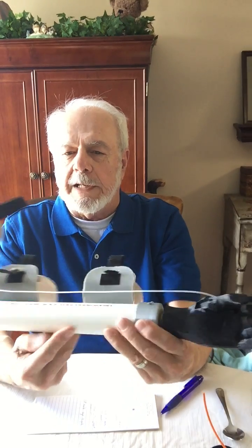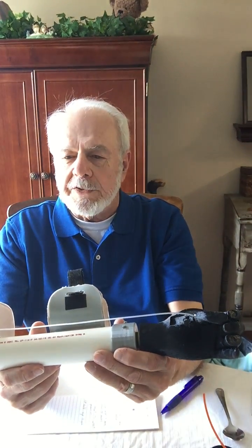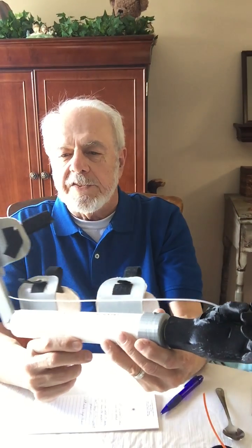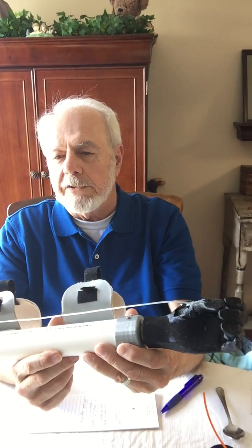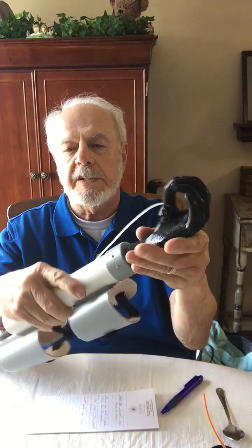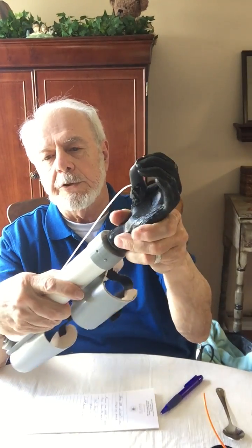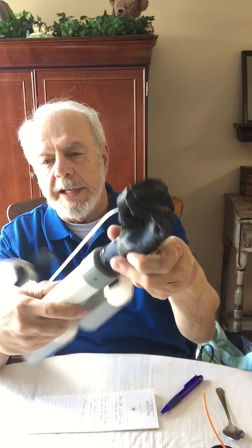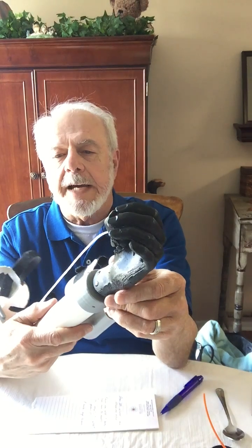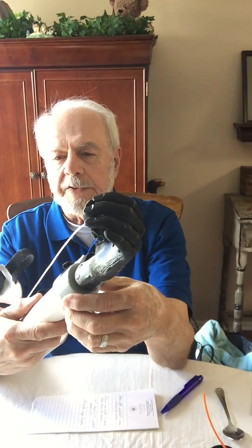I'm calling this an emulator. The idea is to emulate the prosthesis so that an able-bodied person can see what it's like to use this particular terminal device. And so the terminal device, as I mentioned, connects to the prosthesis or the emulator with that half-inch 20 screw, and it can rotate and stay where you put it by the fact that there's that frictional ring between the device and the prosthesis.